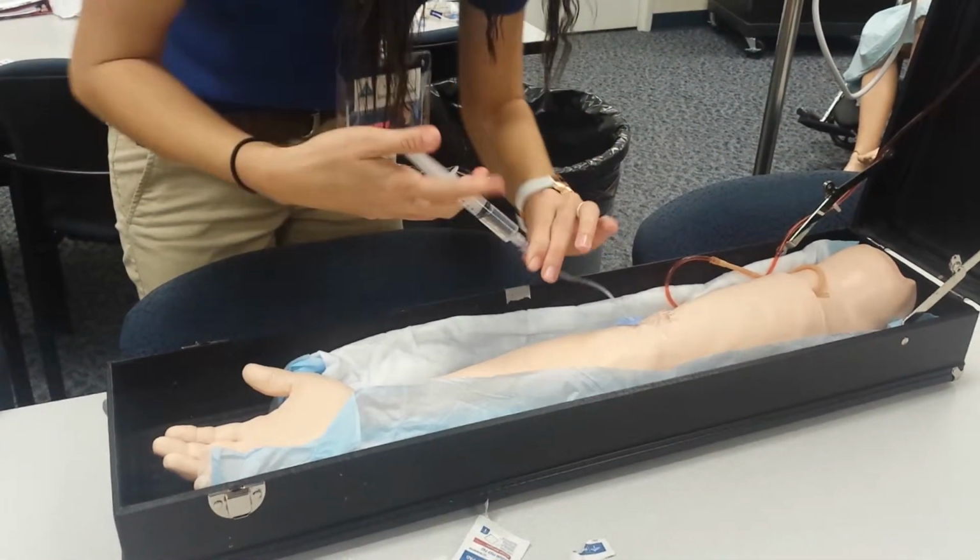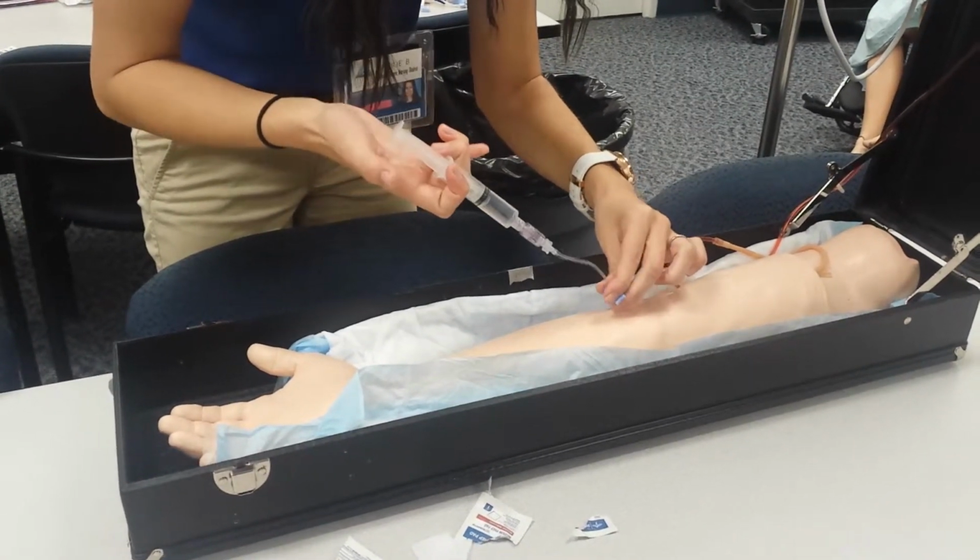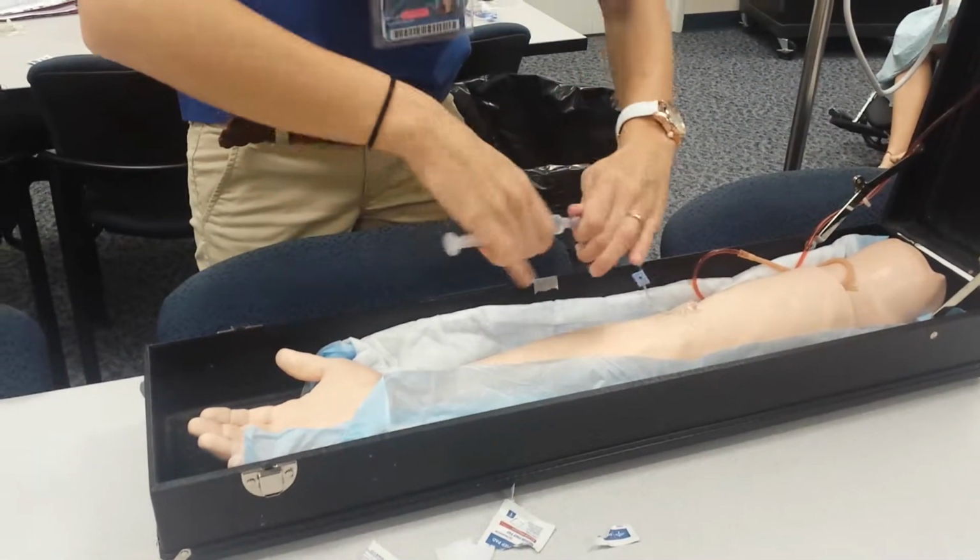I'm going to aspirate, push, aspirate, push. Using positive pressure, I'm going to clamp this, and if this were a PICC line or any kind of internal device, I would use heparin flush to finish.